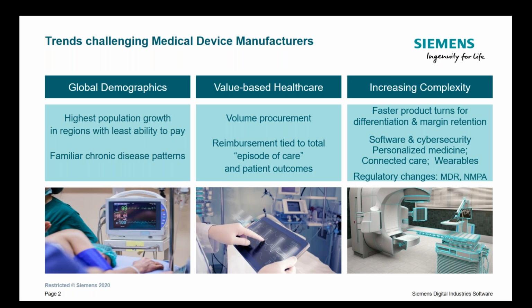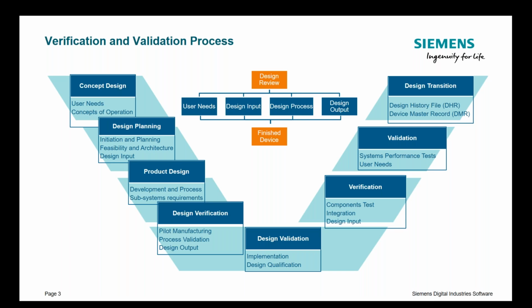Thank you, Daniel. So to get us started, we're going to begin our session today by considering the traditional V-cycle for product design, which is shown here. The FDA specifies content of design control on the basis of design elements and not on design documents, which is why we're talking about this here. The expectation there is to break user needs down into design inputs, design outputs, and then the commensurate verification or validation testing. Our process here follows this methodology for a submission that mirrors exactly the process expected by regulators.